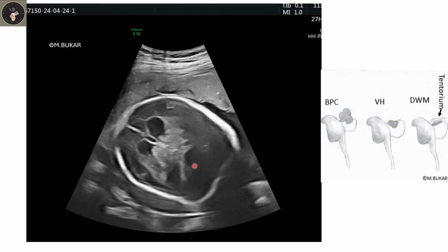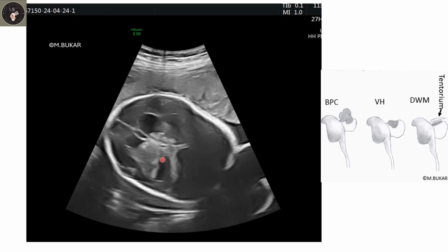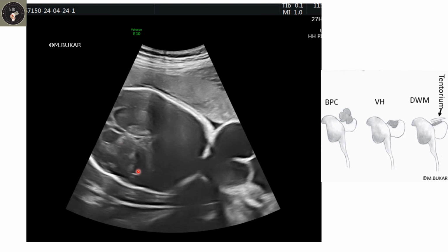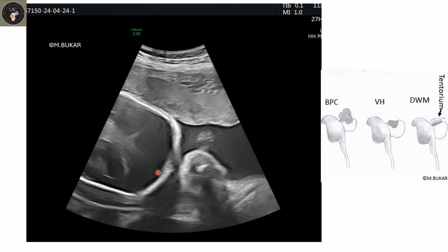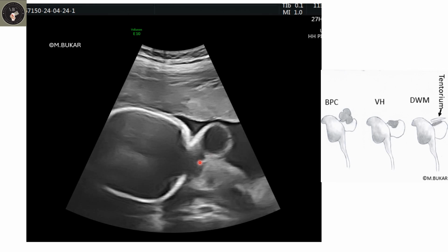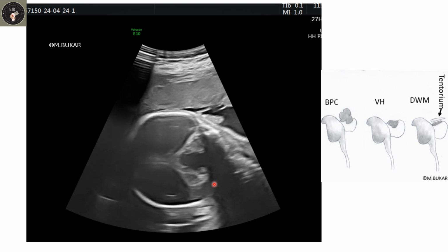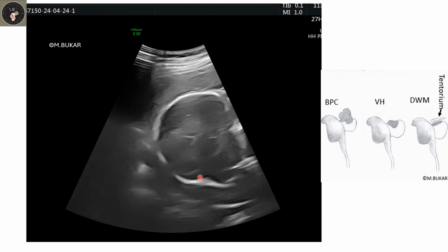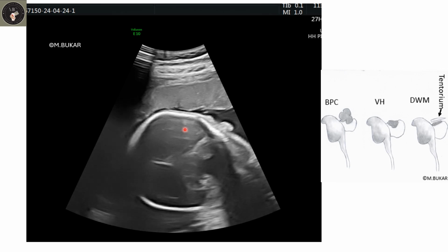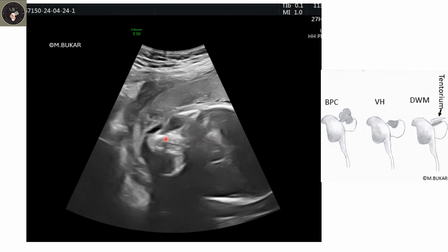See, showing the cyst in the posterior fossa, dilated lateral ventricles, dangling choroid, and somewhat appearing like a teardrop, which is a feature of partial agenesis of the corpus callosum. Here, note the bifid occipital meningocele. Because Dandy-Walker syndrome could be associated with midline facial defects, it's also important to closely assess the facial profile.